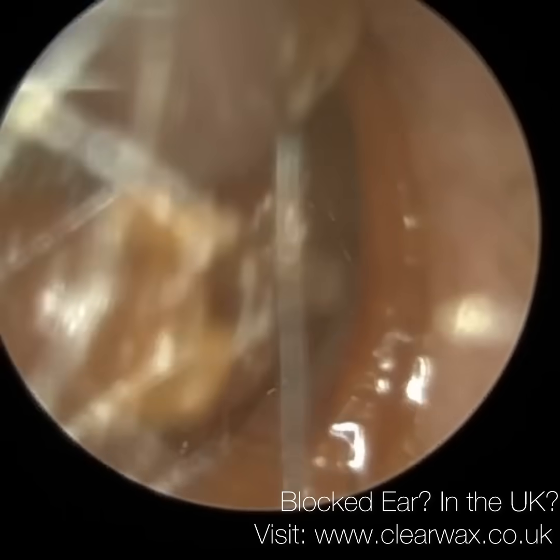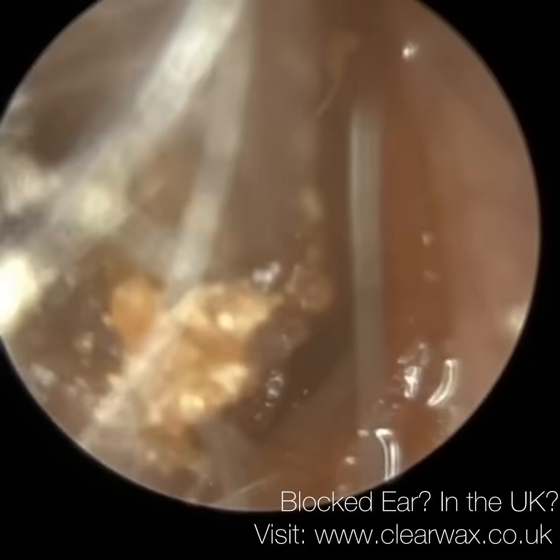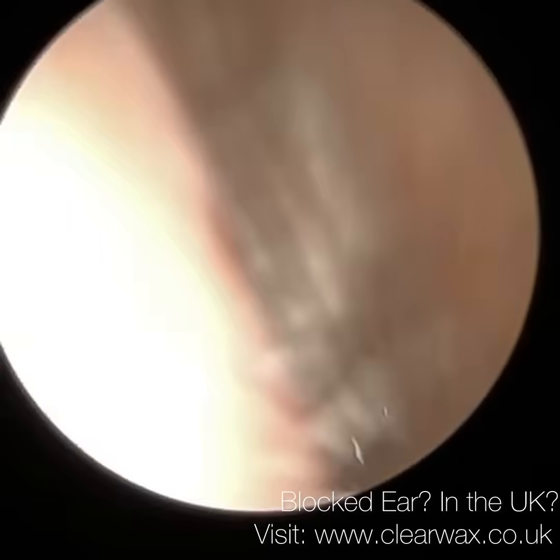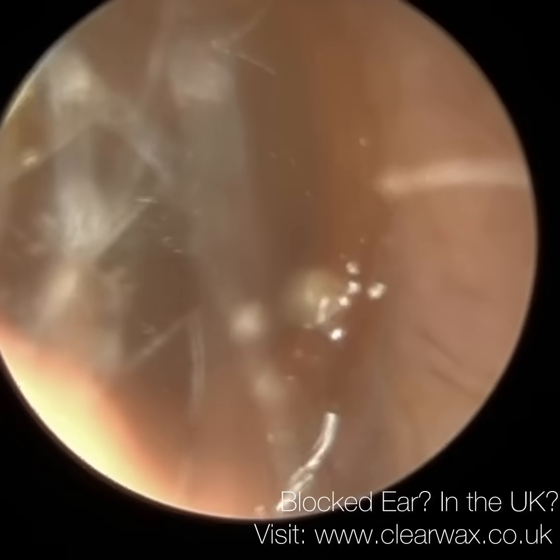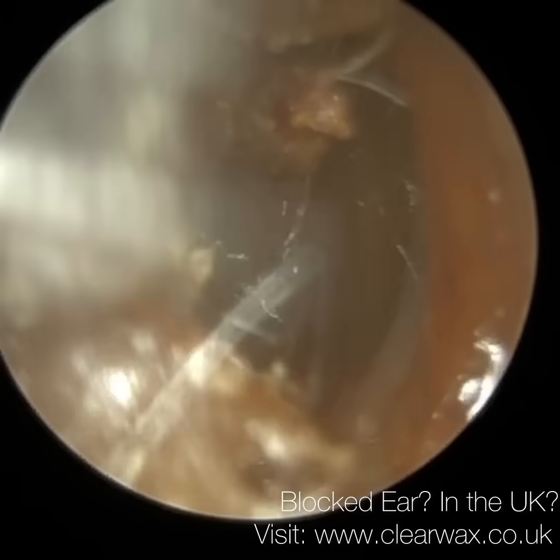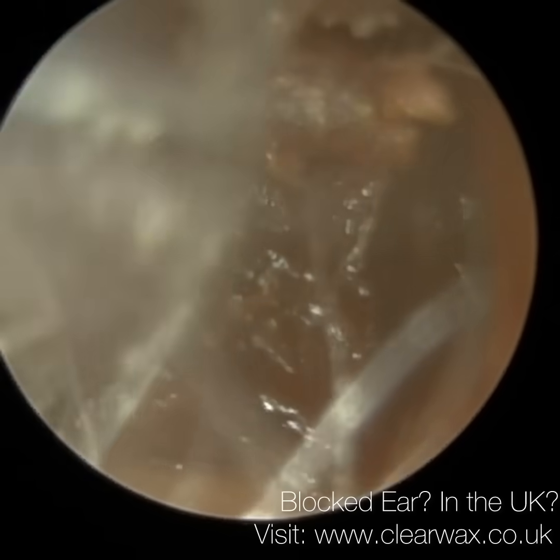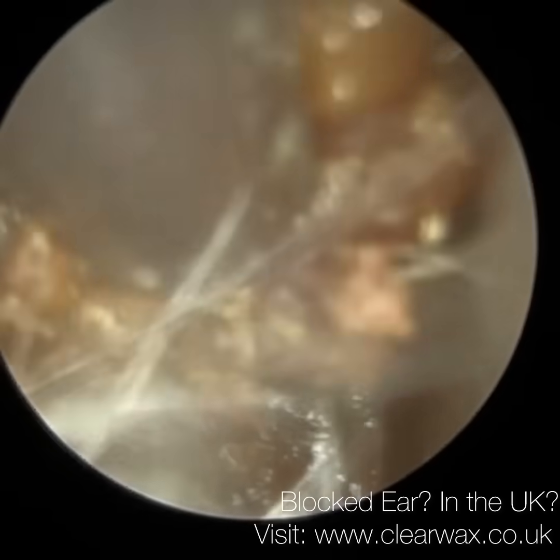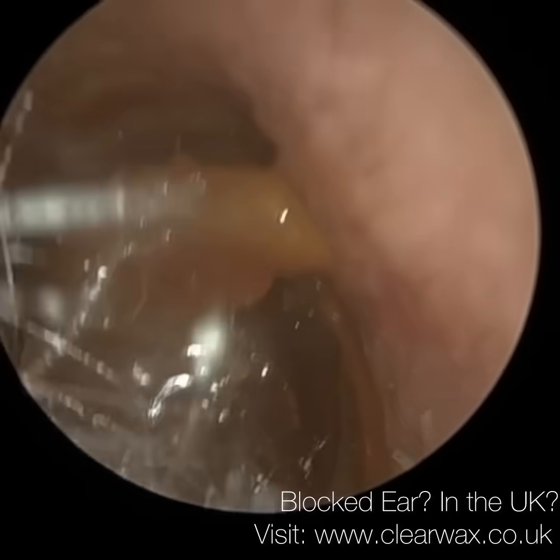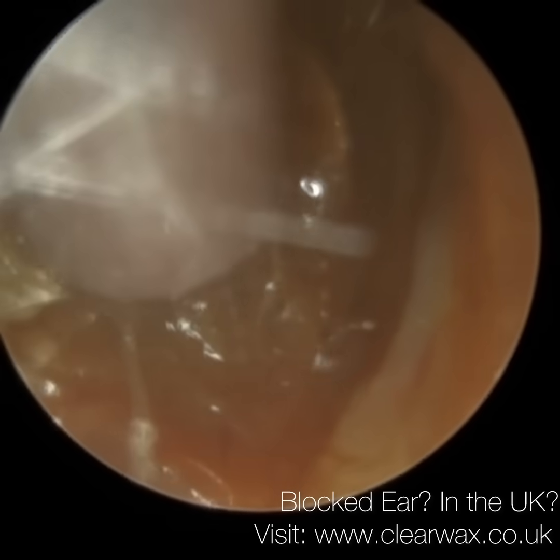And the main challenge with this patient is just dilating and distending the entrance of the ear canal to gain access into their ear. And you may have seen there also, they've got quite a few terminal hairs protruding from the first bend. And at times, this was slightly obscuring the view, particularly when I put the oil in. So when we put some oil in to soften this wax and change the consistency, some of the oil can coat these hairs. And it can occasionally get a bit blurry, but we still managed.